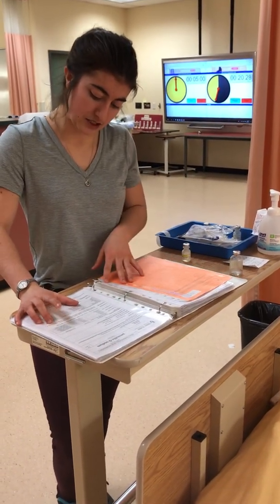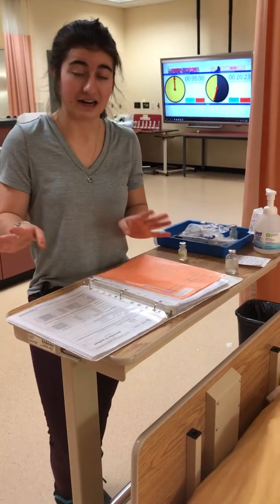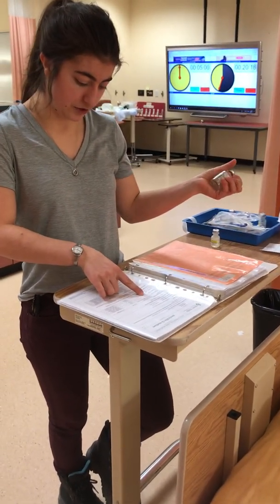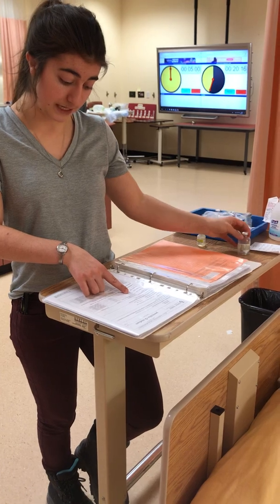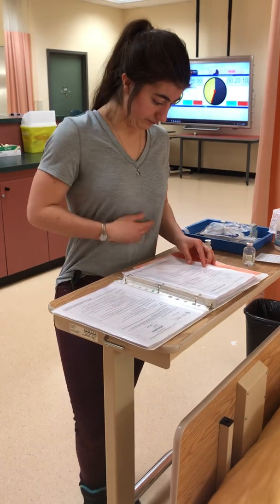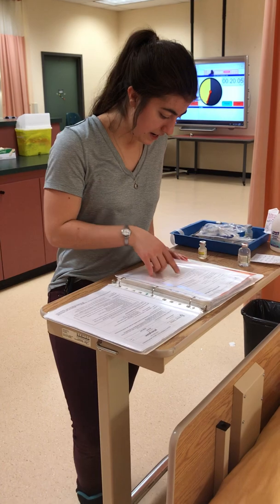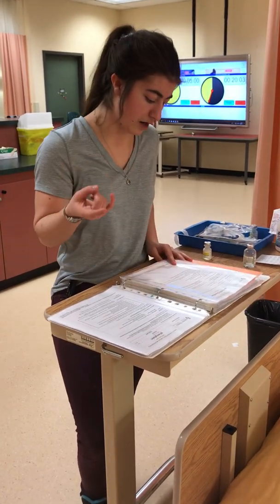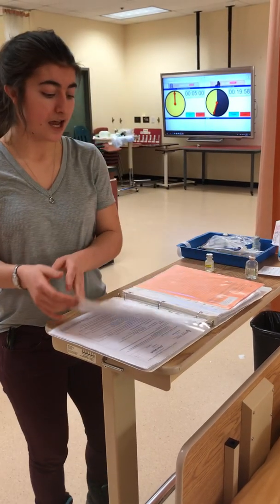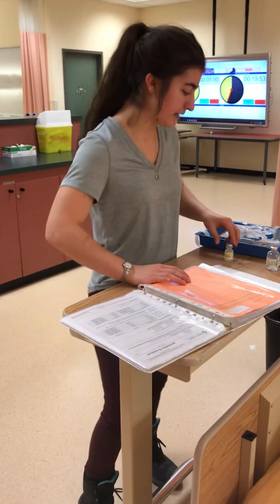It also says to administer it over 15 to 30 minutes, and I've decided I'm going to go with 30, again, to not overload my patient with fluids. For reconstituting this, I'm going to be putting 3.1 mL of normal saline in there for a total volume of 5 mL. It's compatible with the normal saline, we've already checked. And there are a couple of complications to look for: heart failure, rash, electrolyte imbalance. So I'm going to make sure to be thorough with the vitals and make sure that she is stable while giving this medication. Alright, so I am ready.